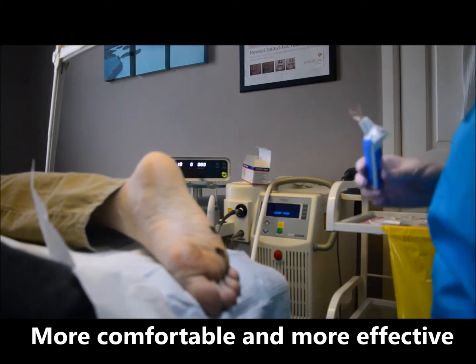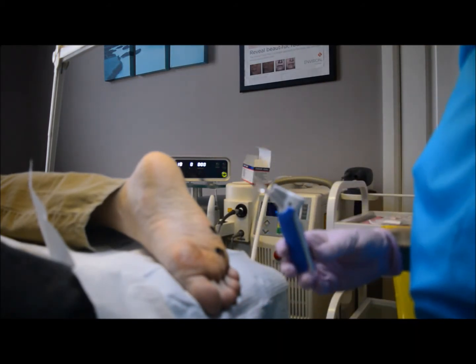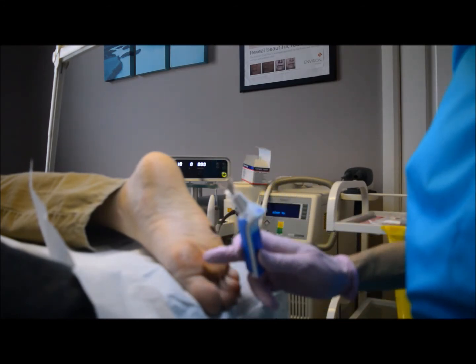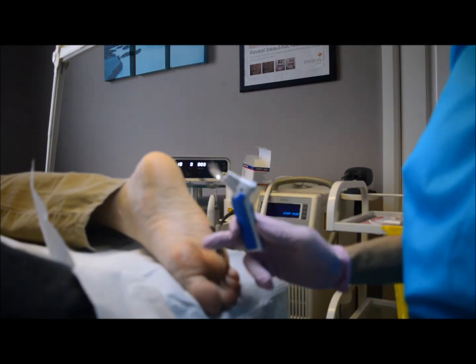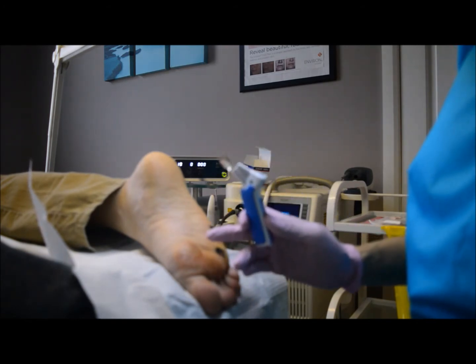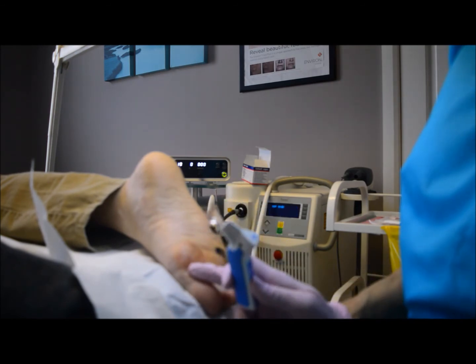By using this vibration anesthesia device — the VAD — we can successfully get analgesia in there to maximize clinical outcome, and I'm actually able to deliver a lot of energy, whether it be infrared light energy from an Nd:YAG laser or microwave energy from the Swift.